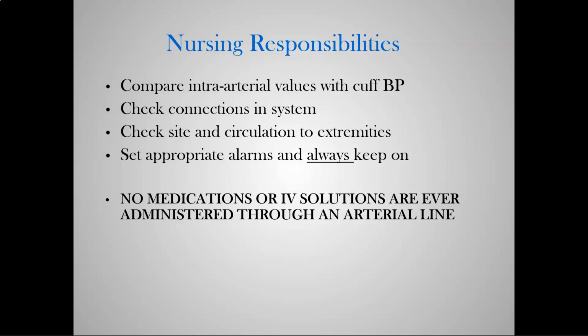Look at your lines, look at your connections. Are they all together? Are they sealed? Yes, good. Okay, look at your insertion site. Is your tubing kinked? Is your tubing coming back? Is it coming out? Does your dressing look dirty? Does it need to be cleaned? Has it been 7 days? Because we change these dressings every 7 days.